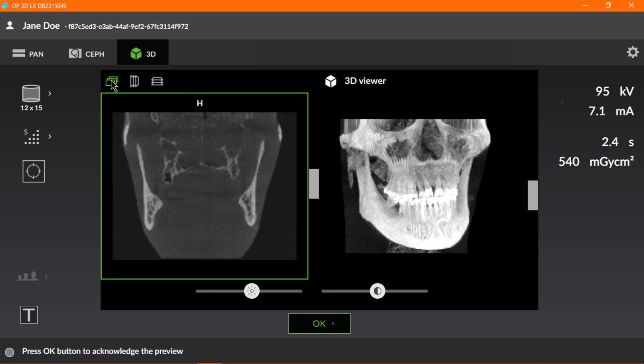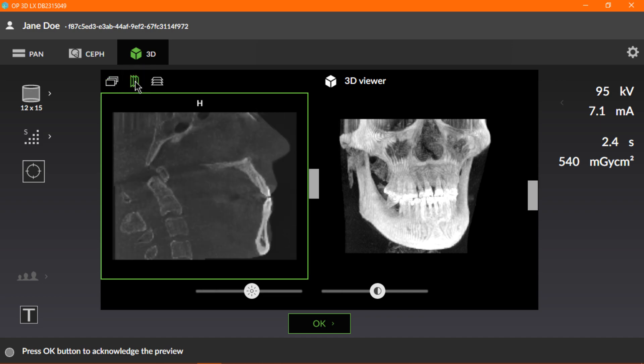The next icon is used to display the sagittal view. Here, we'll see H, which indicates the head-foot view.